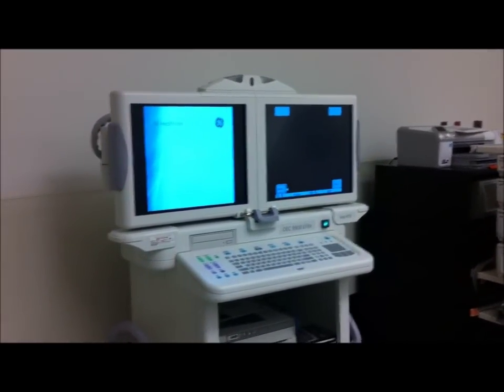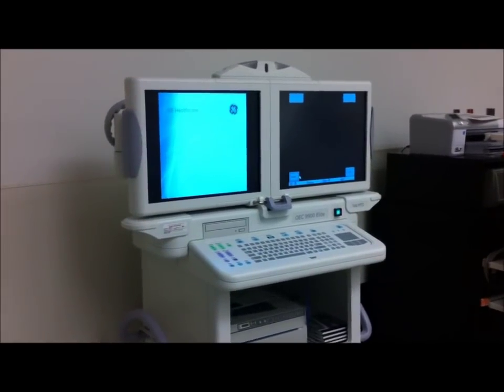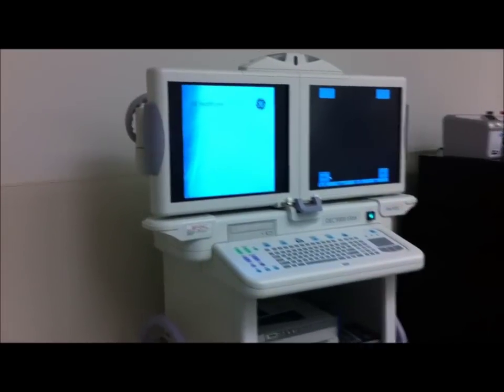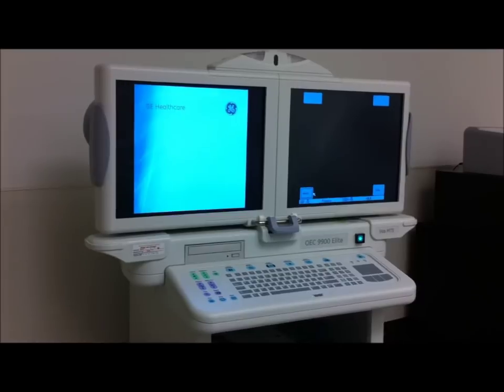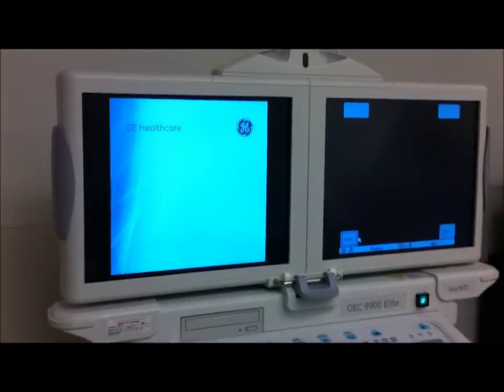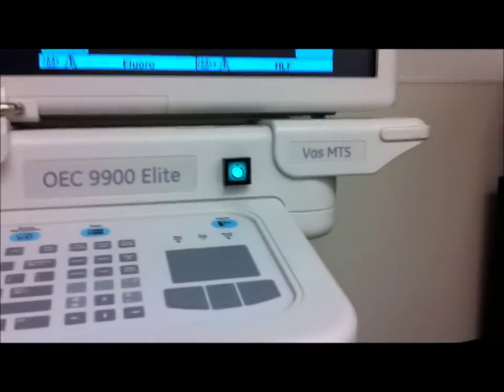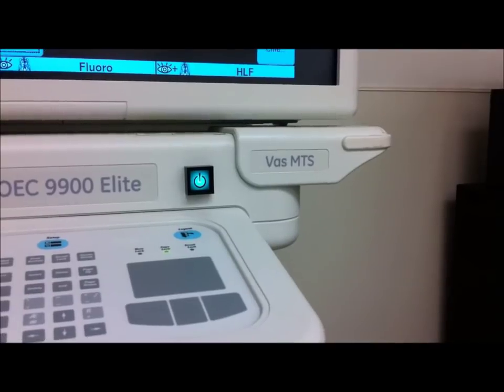This is a video of the OEC 9900 Elite Series, a C-Arm made by General Electric. My name is Kelvin and I'll be giving you a little tour about this C-Arm. This particular one is a vascular MTS model, which stands for Motion Tolerant Subtraction.